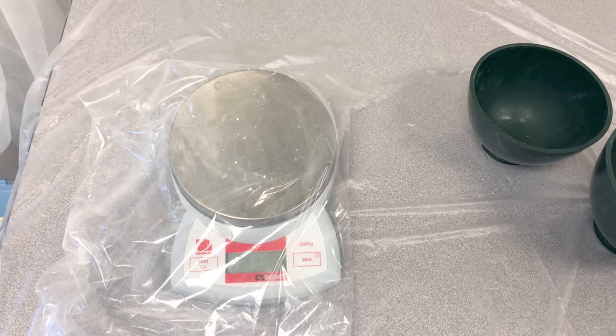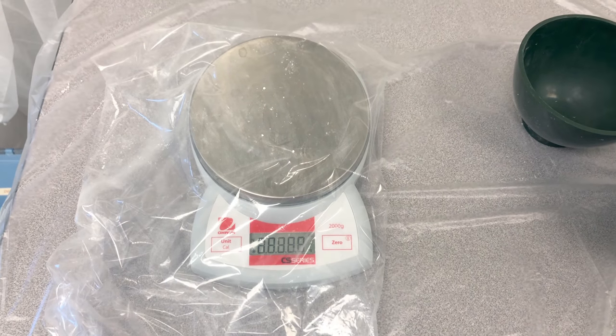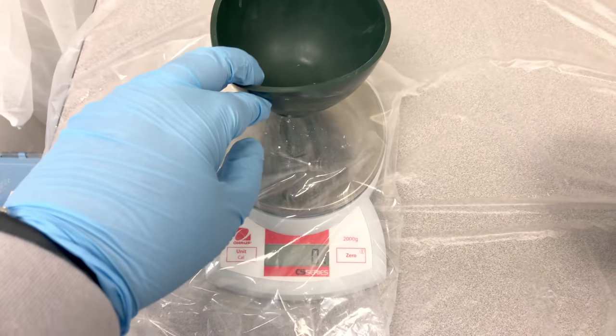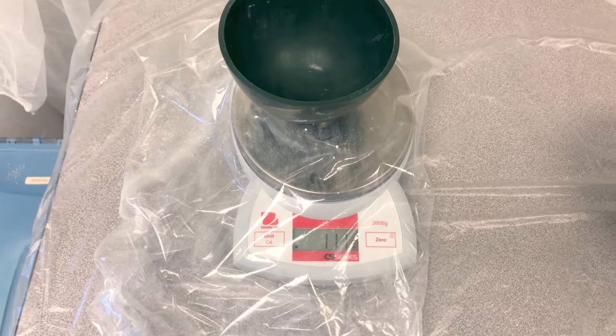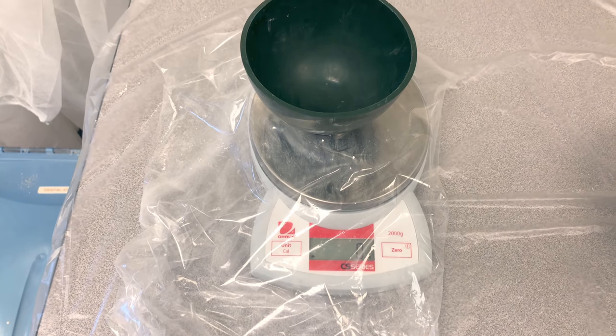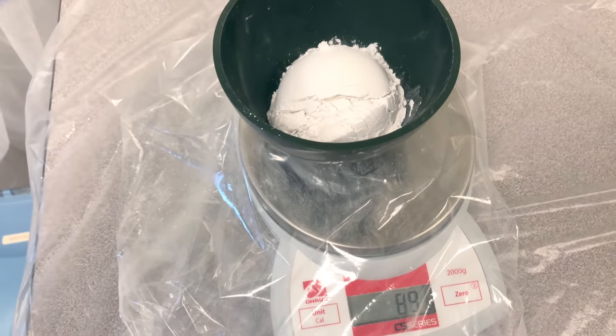When you're ready to measure your powder, turn your scale on if you're using a digital scale. Place your bowl onto the scale and zero it out. We want 200 grams of powder and we don't want to include the weight of the bowl. Add enough powder into your bowl to get 200 grams.